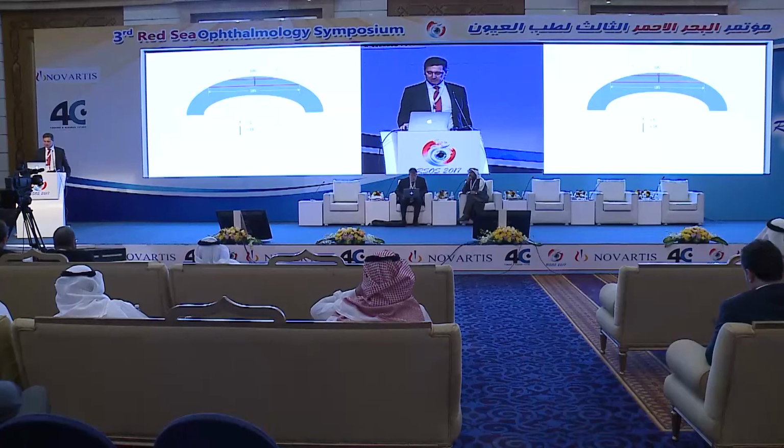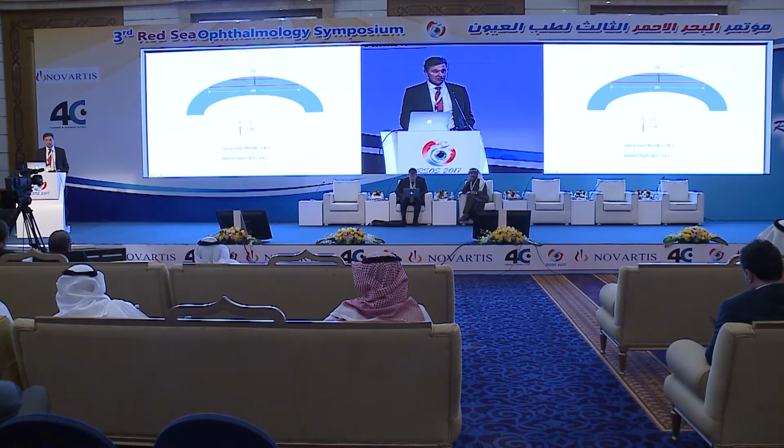It's much more significant. So if you look at the ablation depth across an arbitrary 100 measure versus a measure which is this size, you'll get to the point where you're doing 5 at 100, but you're doing 18 when you're doing the slightly bigger zone. So you've increased the optical zone by a factor of 1.85, but you've increased the ablation depth by 3.6. So when you do see these high order ablation profiles, you've also got to bear in mind that if everything's concentrated centrally, it's going to have a much bigger effect, and bear that in mind when you make the adjustments.